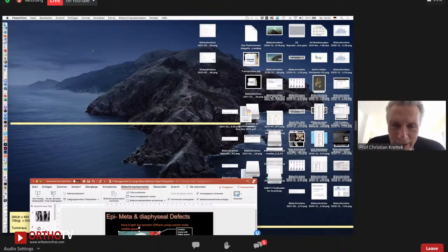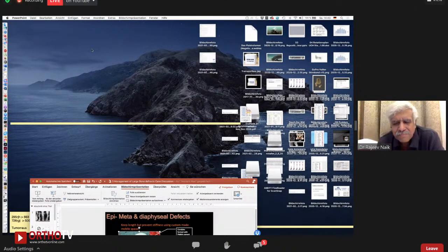Two cortices have double the pullout resistance compared to one cortex. One cortex has become popular because people say there is less risk of fatigue fracture between the prosthesis and the plate. I have never seen really hard data supporting this, so I would have no problem in using bicortical screws.